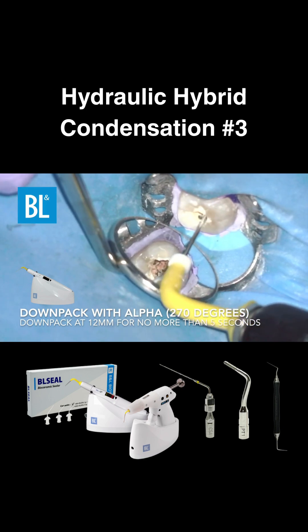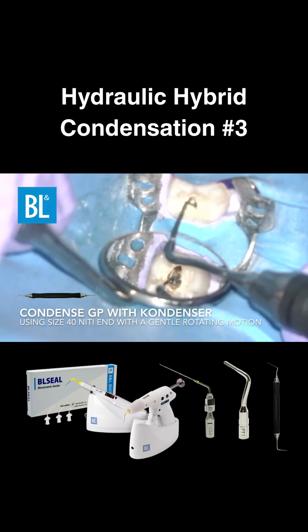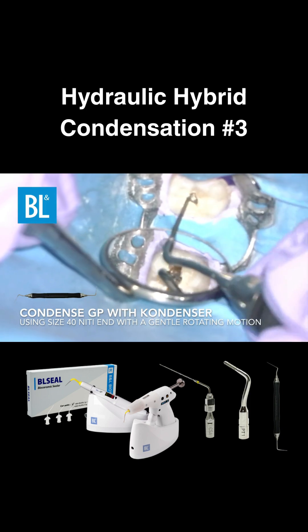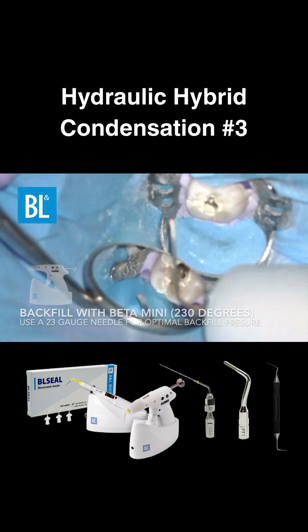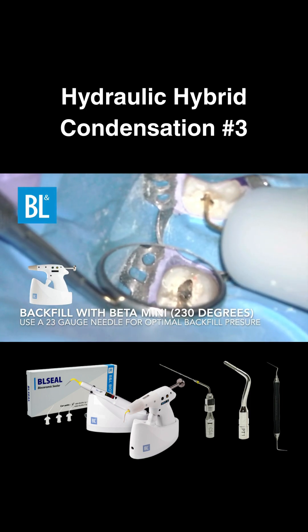Then switch to a size 40 nickel titanium condenser to compact the gutta-percha for a denser apical fill. For backfilling, use the beta mini set to 230 degrees with a standard gutta-percha pellet.